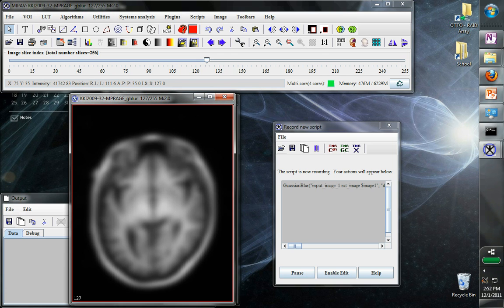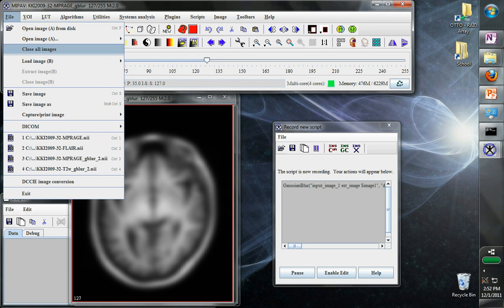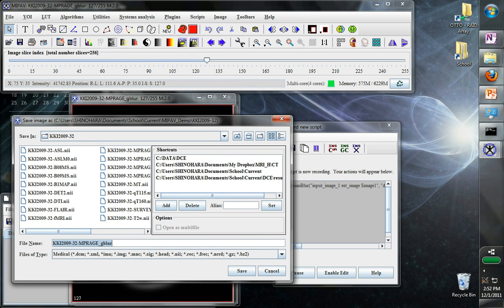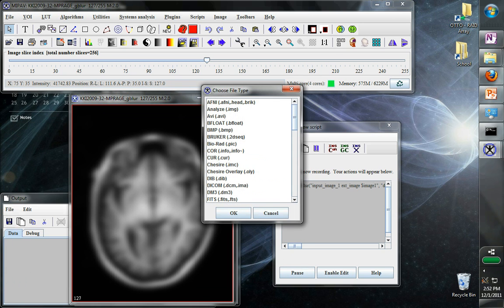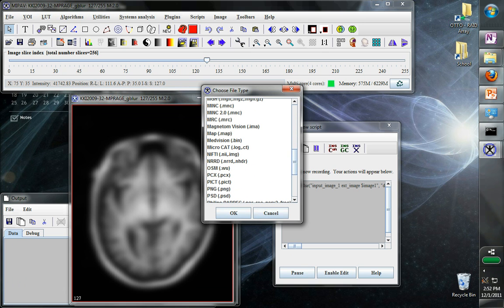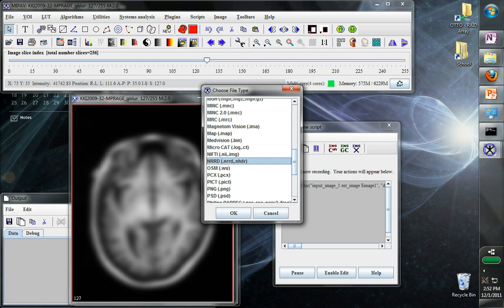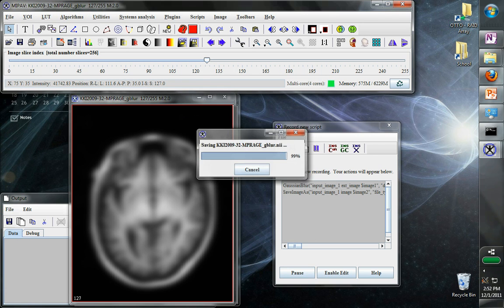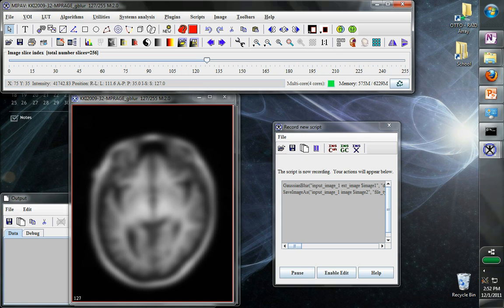So now that we've blurred it, we might want to save this as a different format somewhere else. So we can go to File, Save As, and just put it here. We can tell it maybe we want this file to be a nifty file. We have other options in case we want to save only certain slices, but we want to save them all. Now MiPav knows exactly where we saved the image.